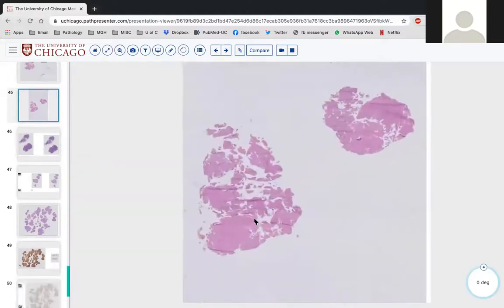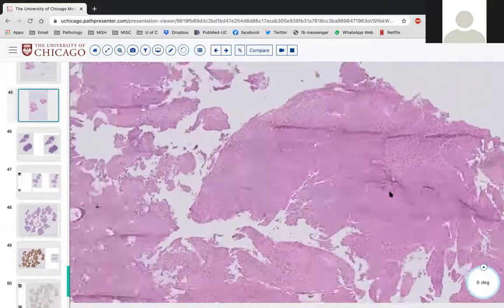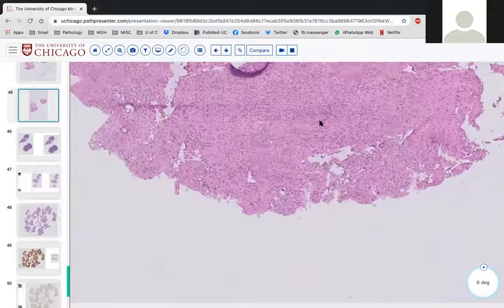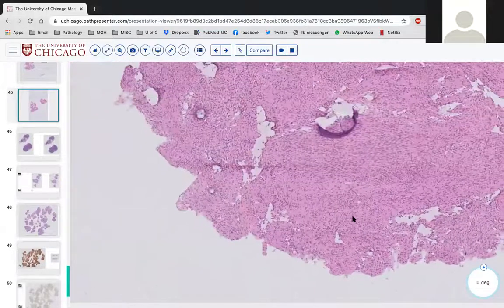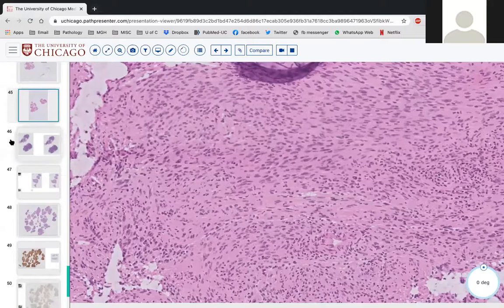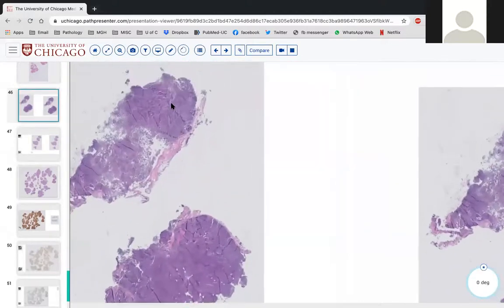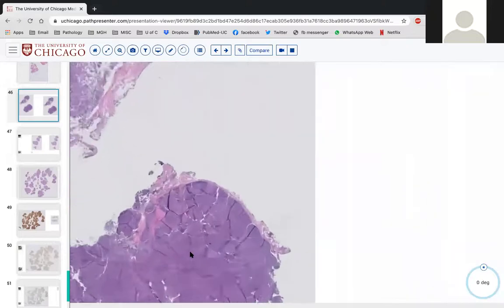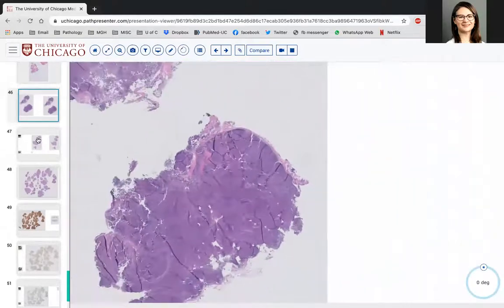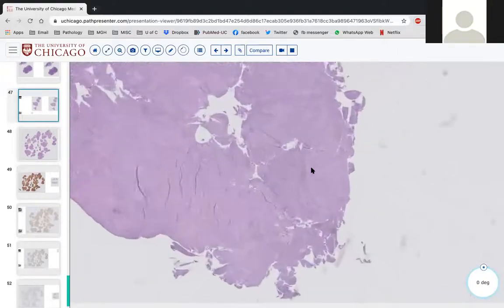All right, so there was one frozen. Here was another. The frozens were composed of, kind of like what you said in the very beginning, Brooke, all tumor, right? So we don't see any normal parotid. We don't see any adjacent fibrous connective tissue or adjacent adipose tissue. And here's our permanent. There's a little bit of adjacent fibrous connective tissue here. That's a lymph node. Oh, that is a lymph node. I don't know why that one got scanned. Whoops. All right.